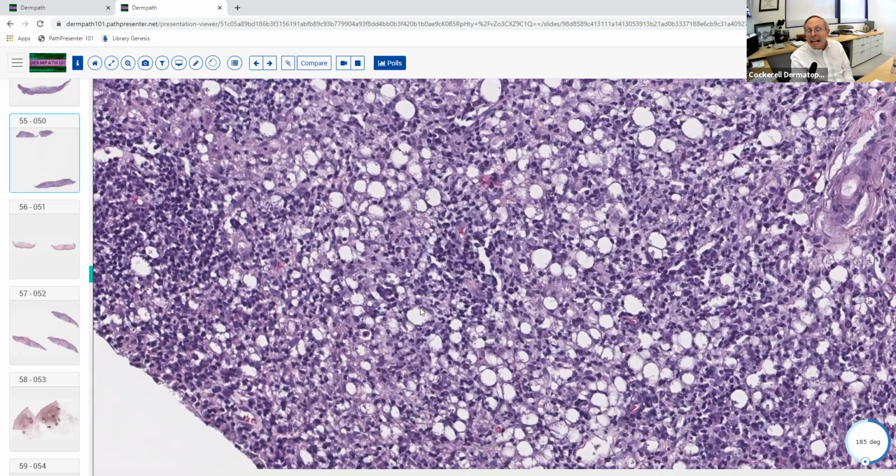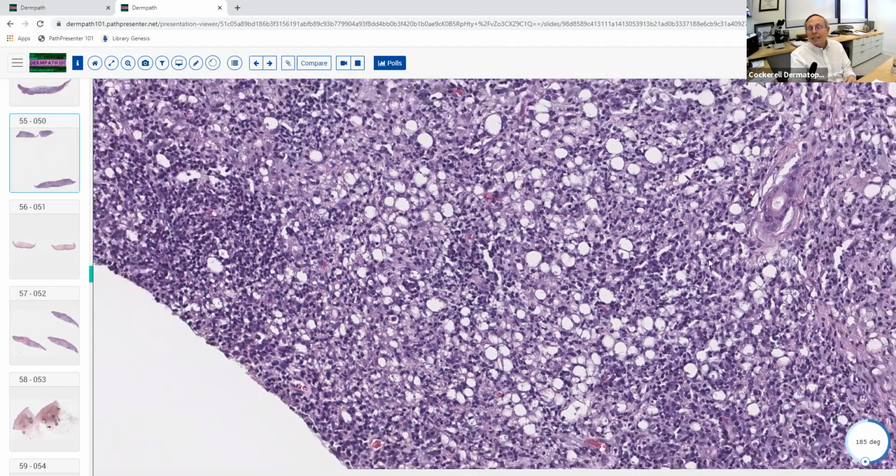Okay, so they're the amastigotes. They don't have cilia yet. There's no flagella here, and mastigote refers to flagella. So when it's got a flagellum, when they start floating around and swimming around in your body, it's got the flagella. When they get in your skin like this, they basically go into this sort of resting stage. And these are all little amastigotes here. So this is cutaneous leishmaniasis.